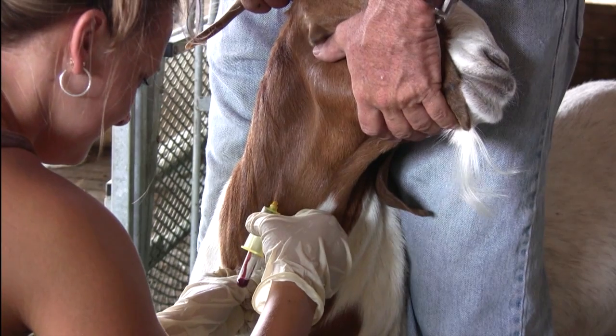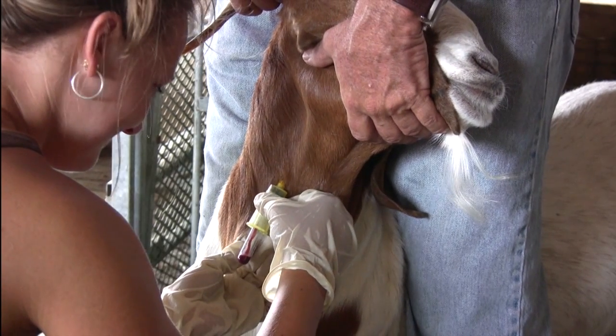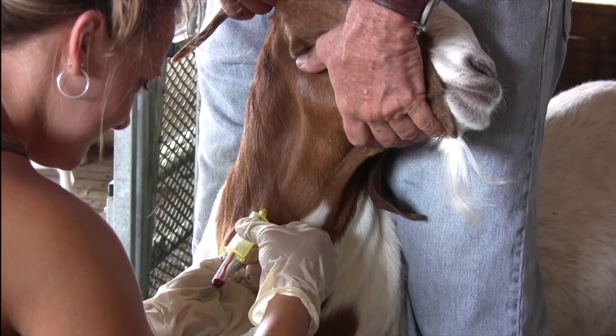If this does not happen, gently move the needle so the tip comes outside of the vein wall and reinsert.